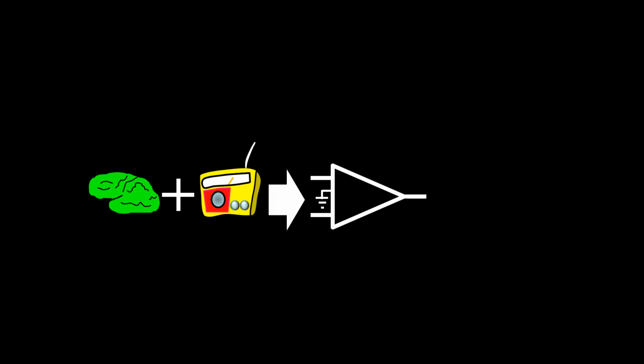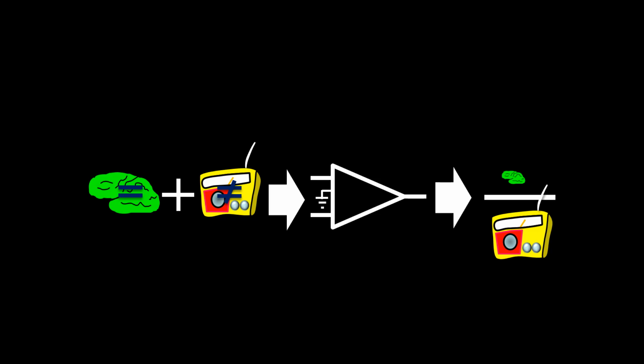The most important attribute of a differential amplifier, the common mode rejection, does not process information according to its worth, but according to its similarities. Thus, in a situation where brain activity is equal and the noise is not equal under two recording electrodes connected to one differential amplifier, the epoch so recorded will be full of noise and the amount of cerebral electrical information will be very little. Such an epoch is obviously bad for interpretation.